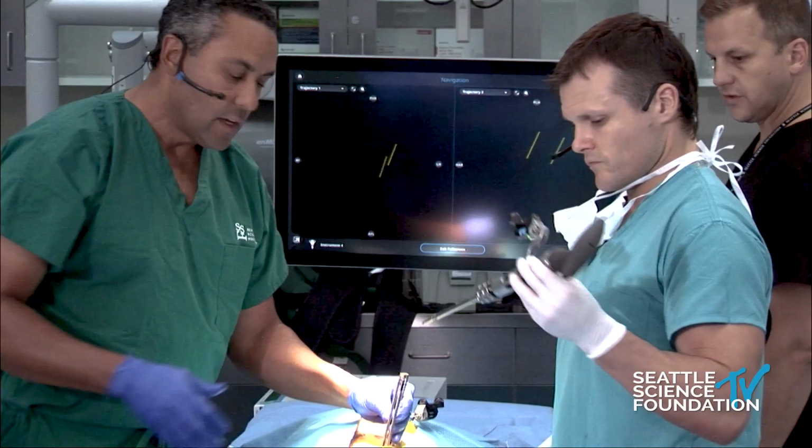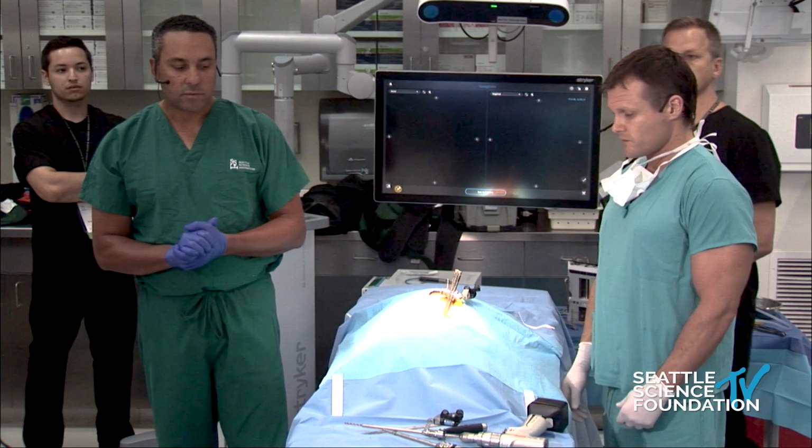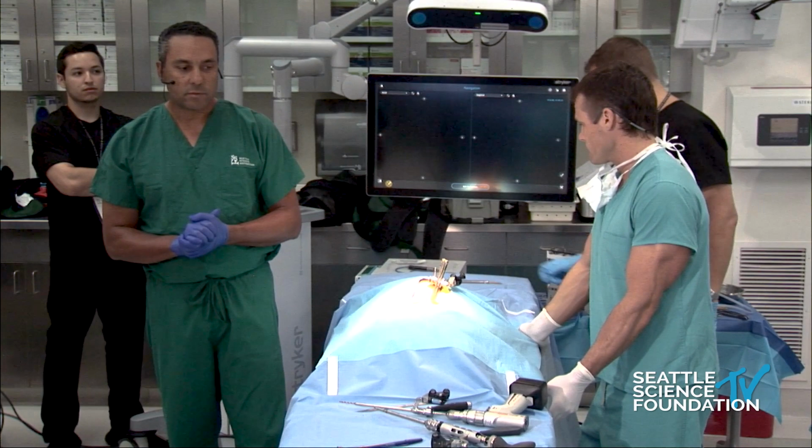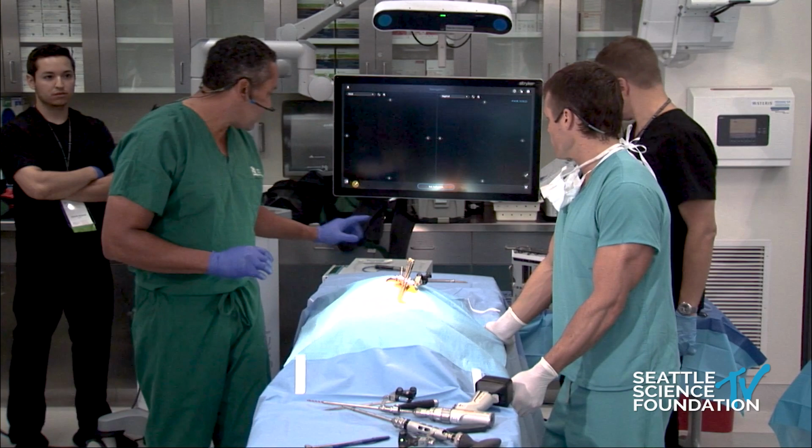I've got a question. Yeah. With more traditional navigation systems, we have been taught that you have to have a very solid fixation of the fiducial to a constant bony prominence. So how accurate is this one that you put on the skin? I don't even know the name of that thing. The spine mask was the thing that I had shown.